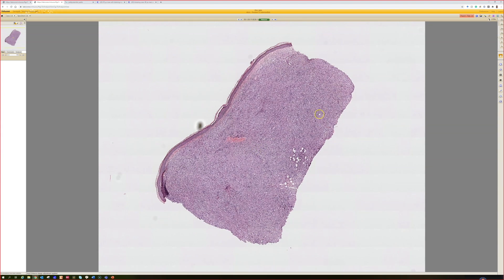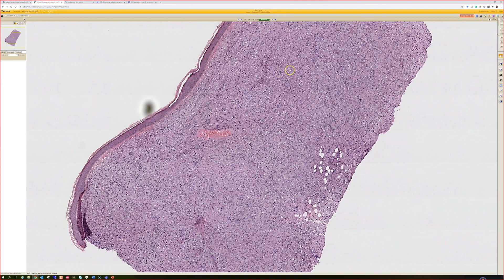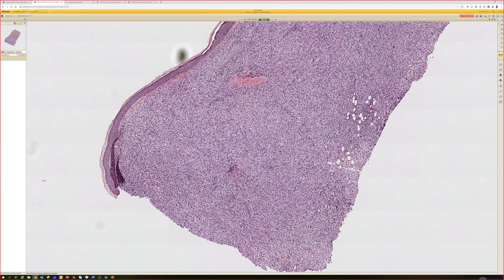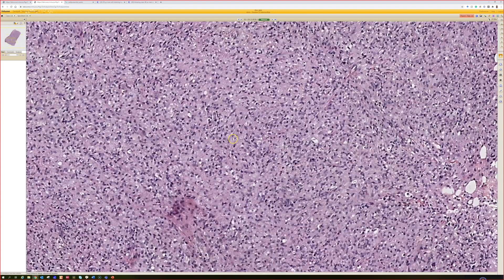Even from super low power you can see a really atrophic epidermis, then a little bit of a grenz zone, and then the dermis is just replaced by a sheet of inflammation.